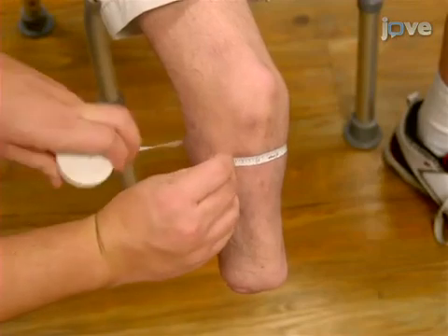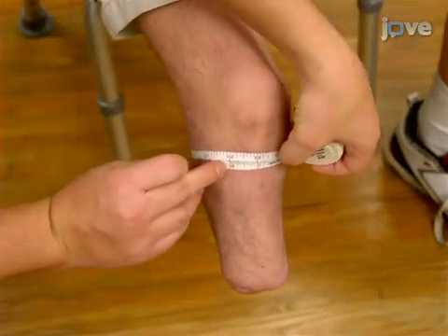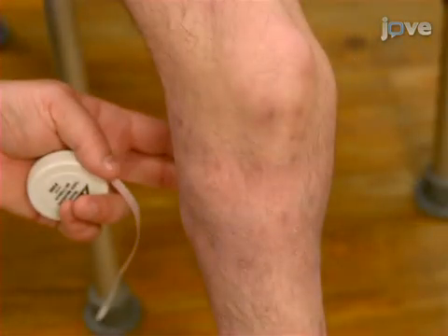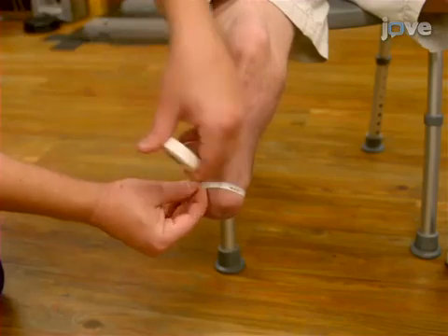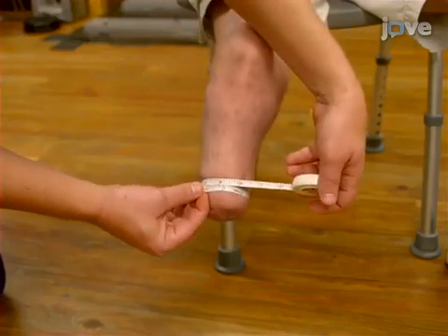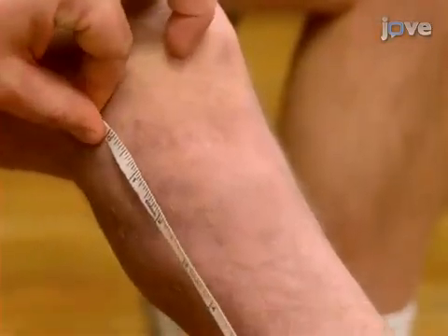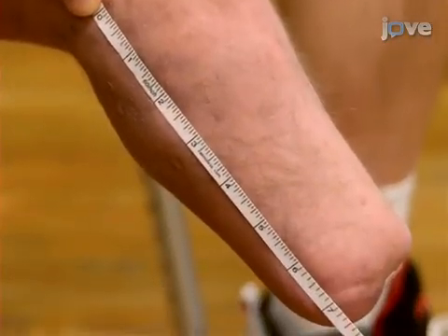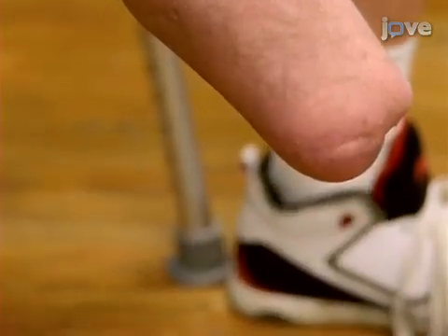Next, measure the proximal circumference of the residual limb, the largest circumference approximately 2 finger widths from the knee joint. Then, determine the distal circumference of the residual limb at the last bony prominence on the distal end. Next, measure the length of the residual limb, the distance from the fibular head to the most distal aspect of the residual limb.